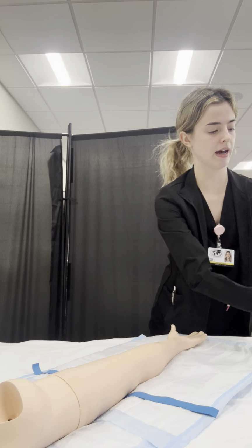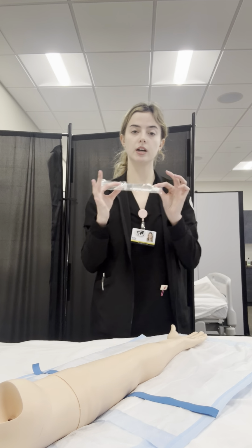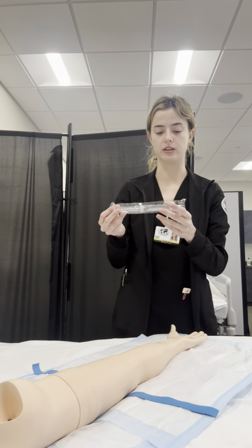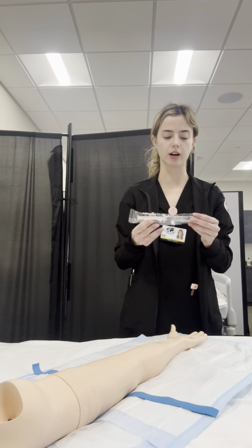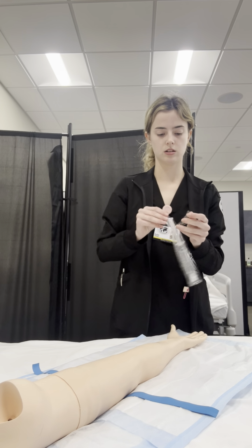Next, I want to go ahead and get my extension set ready. So I'm going to get my normal saline. I am going to read the label, make sure that this is what I think it is. So this is normal saline, 10 milliliters. And then I'd also want to check the expiration date, make sure it's not expired. So this is not expired, it is good to use. Go ahead and open it.